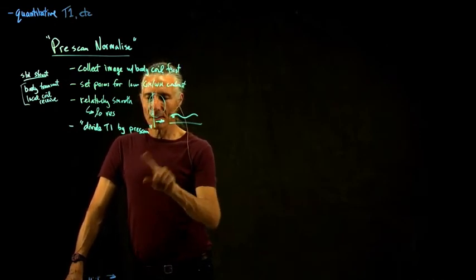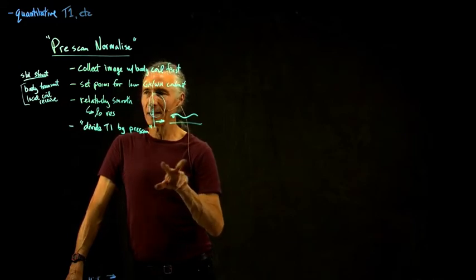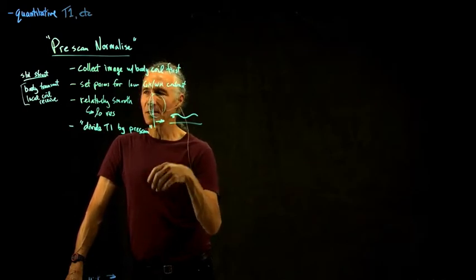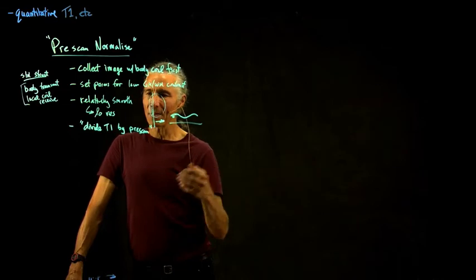There'll be 2 high-pitched scans that run. The first one is a shim scan, and I haven't talked about that yet. We'll talk about that next week. But this is yet another pre-scan that runs.